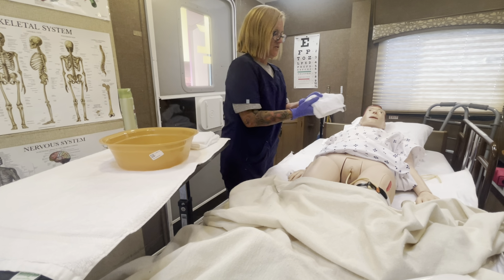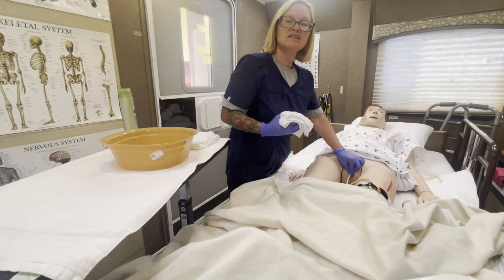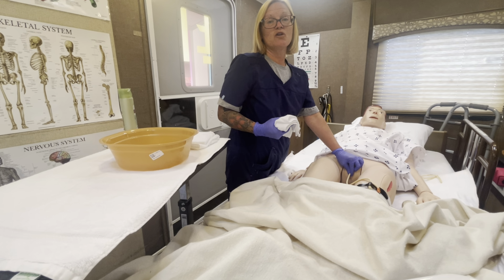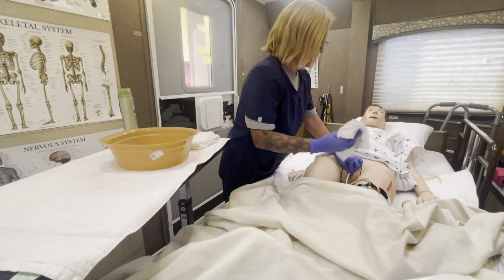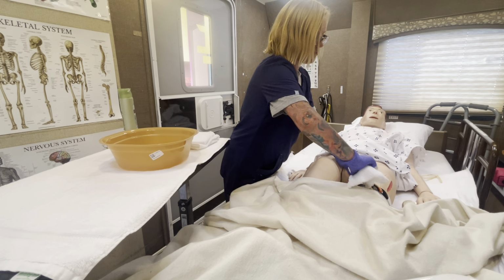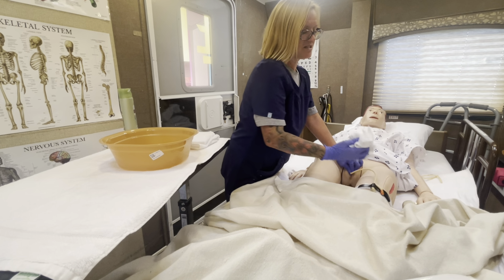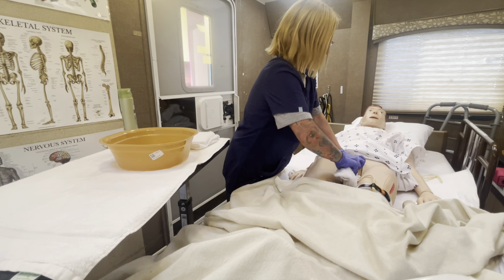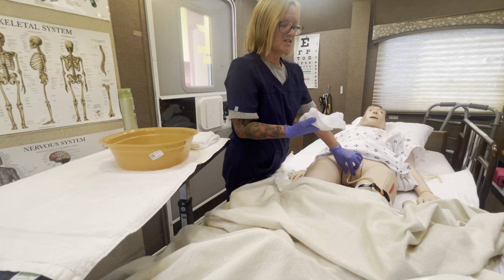Then I'm going to make sure that I pinch the catheter at the meatus. The purpose of this is to make sure that you are not tugging on the catheter. It is very painful for your patient. So I'm going to take my first corner and clean 4 inches down. I'm going to pull this back, grab my second leaf, go 4 inches down.